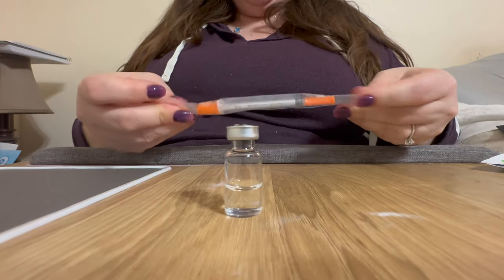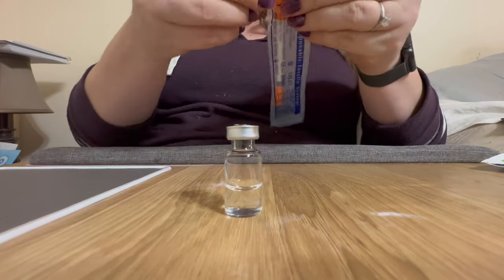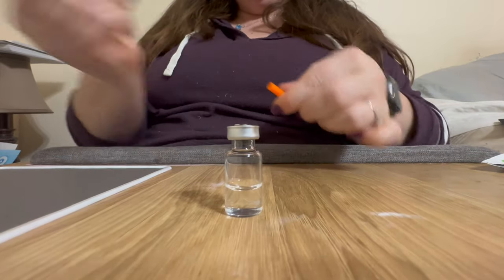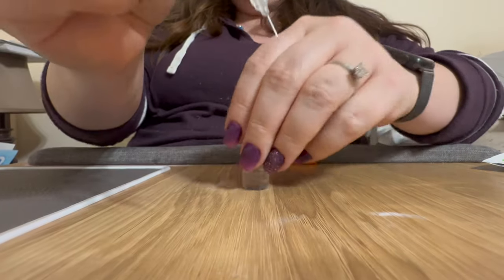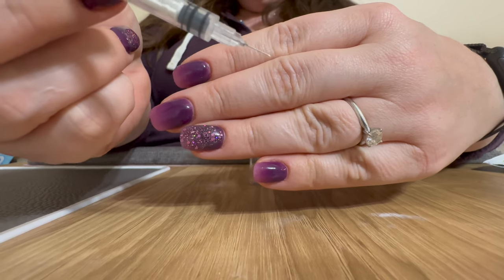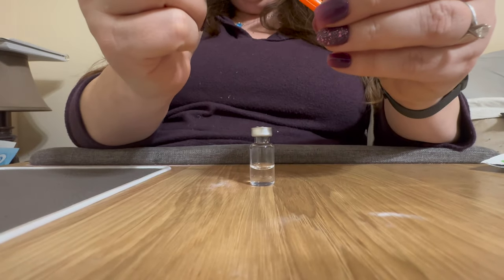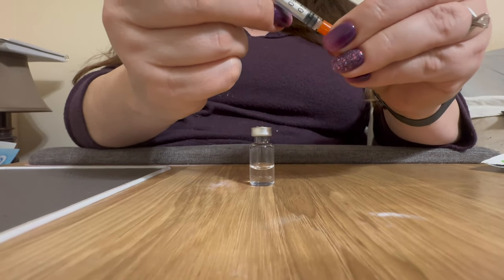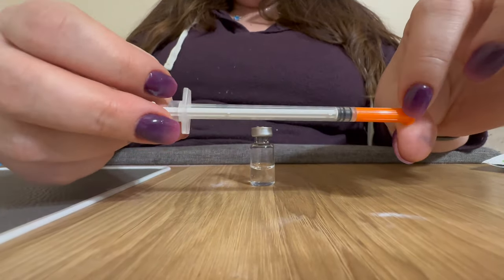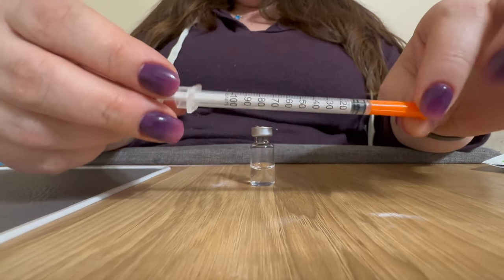To actually give the injection, I use these 1 milliliter insulin syringes. The needle on these is really short — it is no big deal, it's tiny. I was really nervous to give myself the injection manually with these needles at first, but it hurts less than it does with the automatic injector from the Mounjaro.